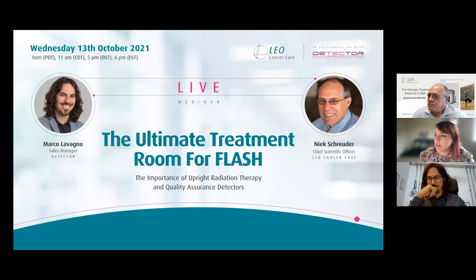Okay, great. Then, is there any damage to your detector from high intensity proton beam? That's a good question. Of course, neutrons are something that I will start with. We have some of our devices established in facilities since 2009. We have the experience of our partners, who have treated patients since 2011 with the same technology, same content, same interfaces, and basically no big damages in years. Of course, neutrons is something that we cannot prevent and cannot understand. It's an electronic board.